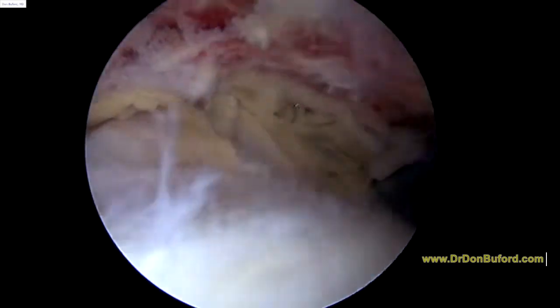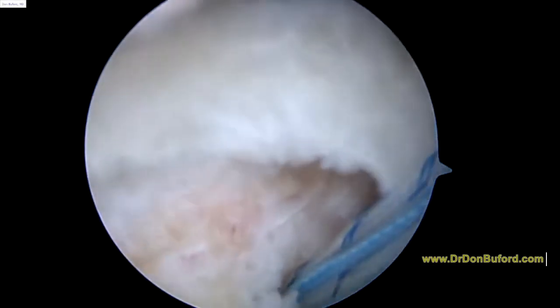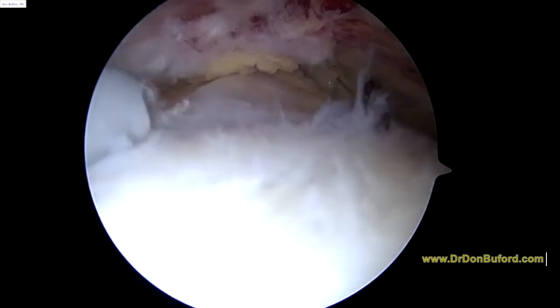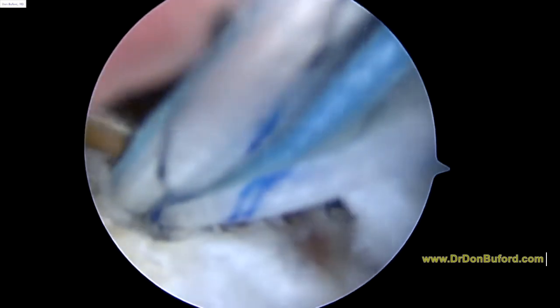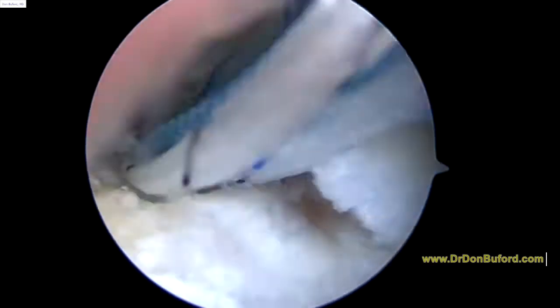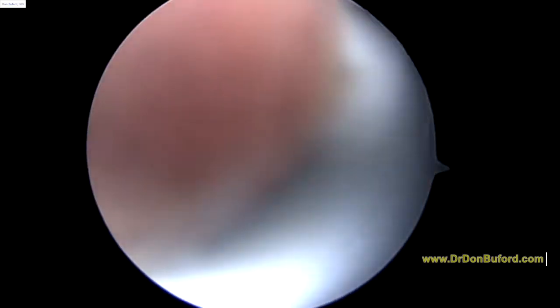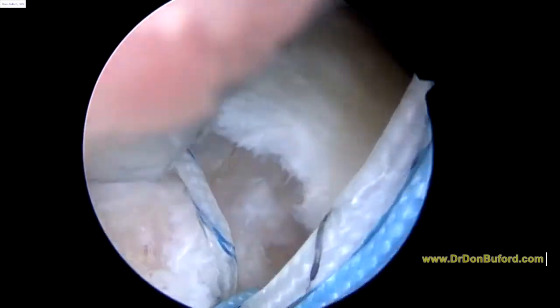Keep this in. We're going to work from right to left on the screen with our suturing device, which means we're going to take out our first suture from the left side of the screen, which is anterior. So I'm going to reach in here from the anterior direction with this instrument that we call a crochet hook, to decide which ones you want to work with first. So I'm going to take this blue and white striped suture first.